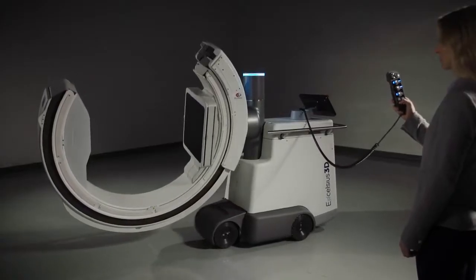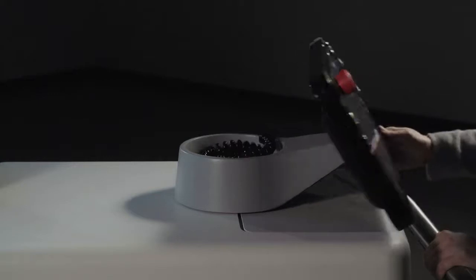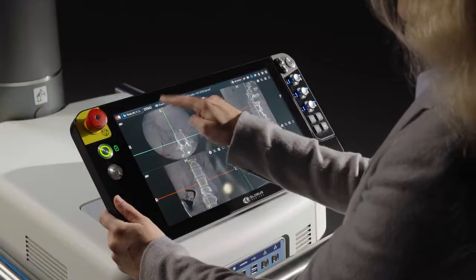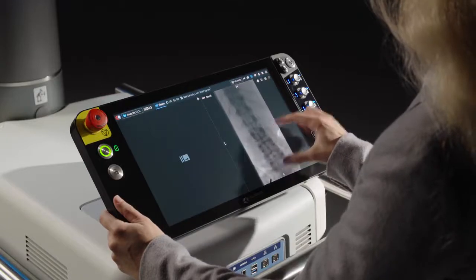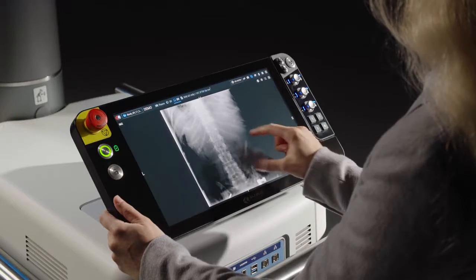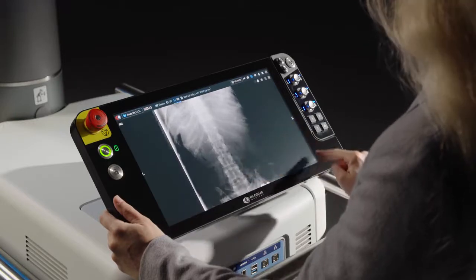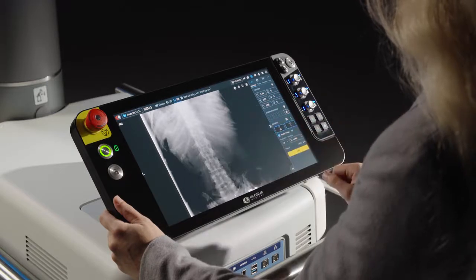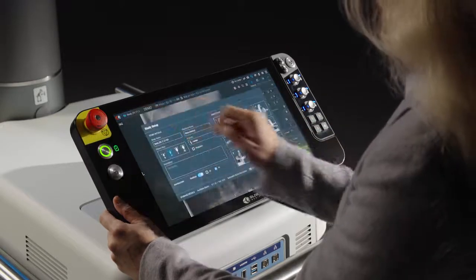The base also holds the integrated touchscreen control panel for system control and image visualization. This eliminates the need for a separate viewing station or cart, simplifying transport and minimizing footprint. The intuitive touchscreen allows the user to easily adjust imaging modalities, positioning, and acquisition parameters.